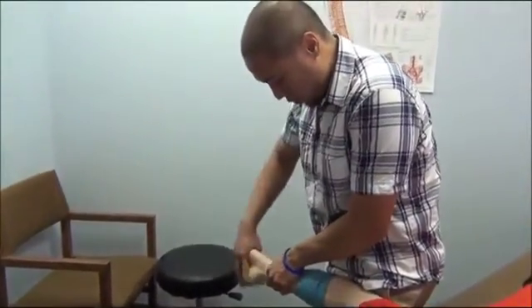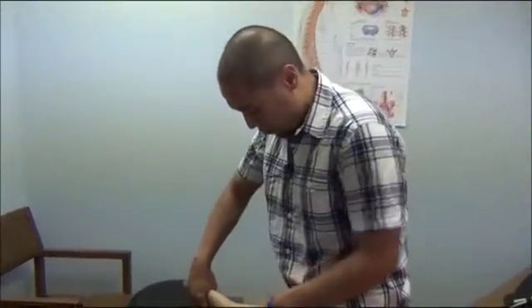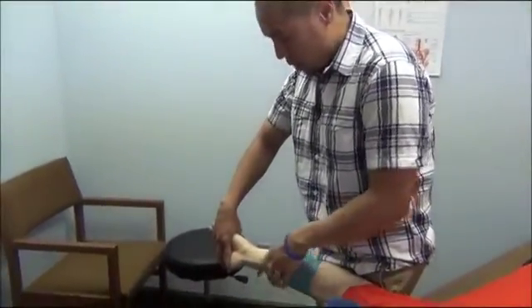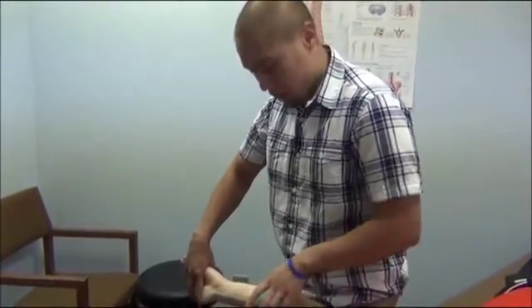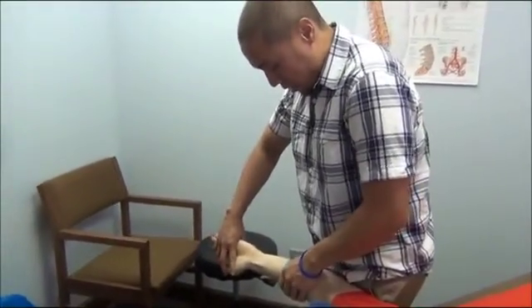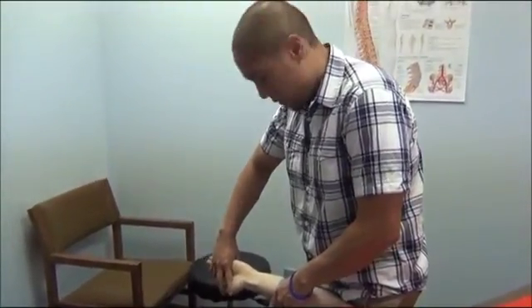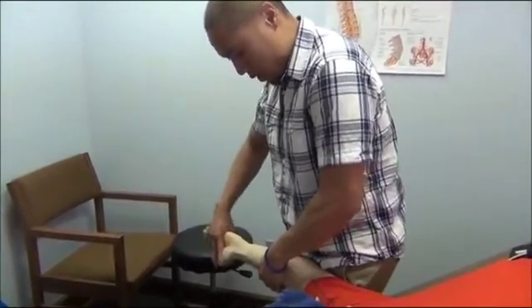Some variations. Again, since much of what we do is very similar to taping, much of what we do is actually just sensation through the skin movement and skin lifting. In this case, it's compression. So I can actually take his skin as it's compressed, as I'm doing the median nerve glide. I can actually pull in the opposite direction for a little bit more stretch.